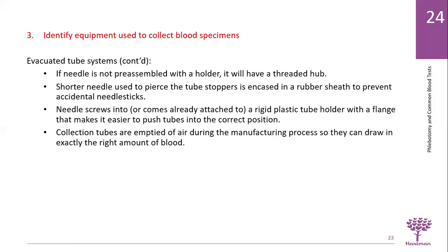Okay. Now, the evacuated tube systems, if a needle is not pre-assembled with the holder, it will have a threaded hub. And I know some of this is going to sound Greek to you initially, but once you get to the lab to see this in action, you'll recognize it. You should also have examples of this in your book.